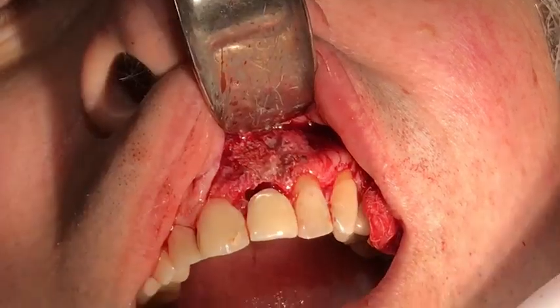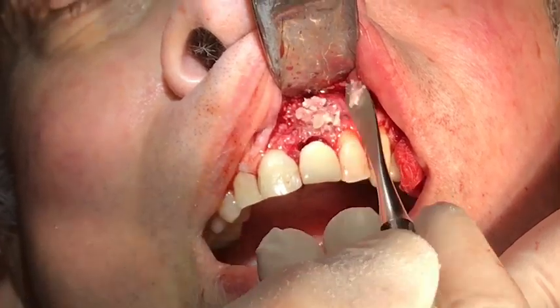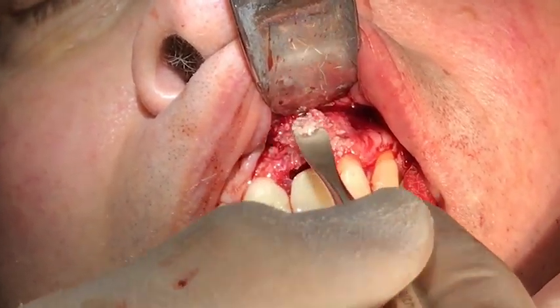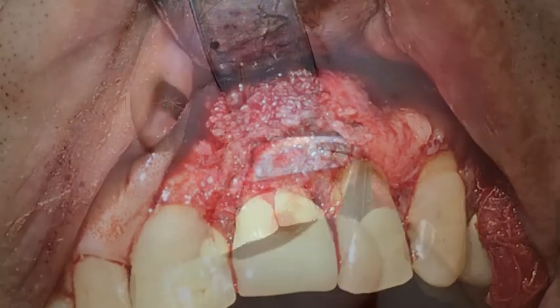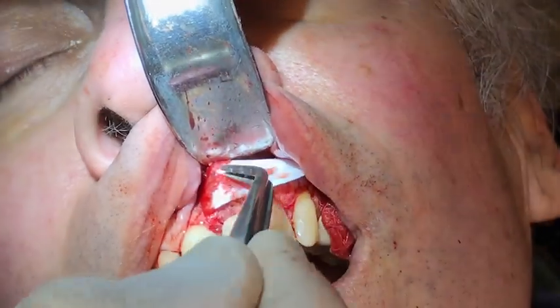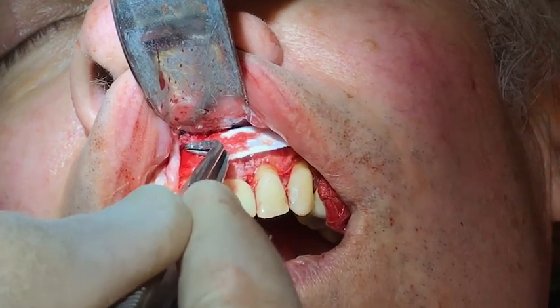Demineralized freeze-dried cortical cancellous bone graft was used. Not only did the bone graft fill the defect, but it bulked out the tissue and filled the void between the implant and the buccal plate of bone. A resorbable collagen membrane was placed over the graft and the tissue was approximated for suturing.